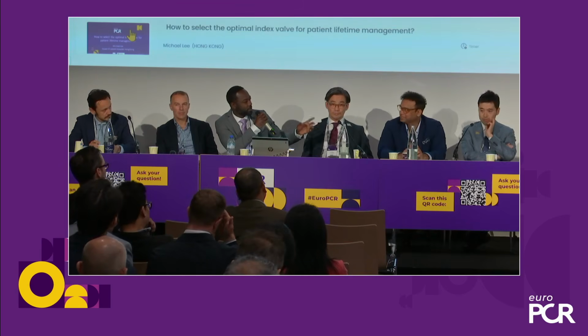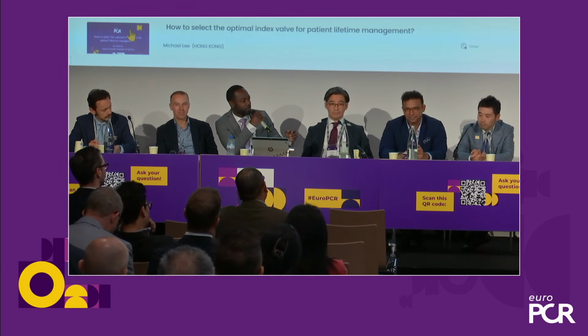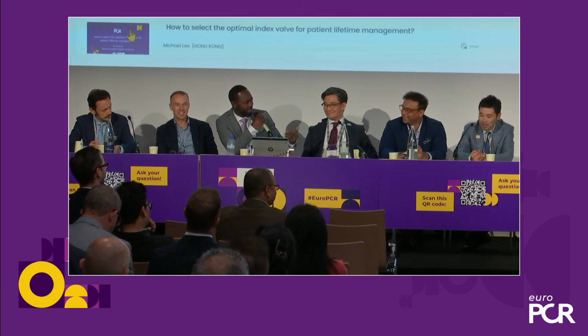No. Our Japanese cohort CT analysis clearly shows that if we implant the valve as high as possible, the sinus sequestration is doubled. So it's very accurate to reduce the pacemaker implantations. It's a trade-off, of course, but I totally agree with Yohei's opinion. So this is a very strong message coming from you guys. You say high, but not too high. Otherwise, we're going to impact the outcome.